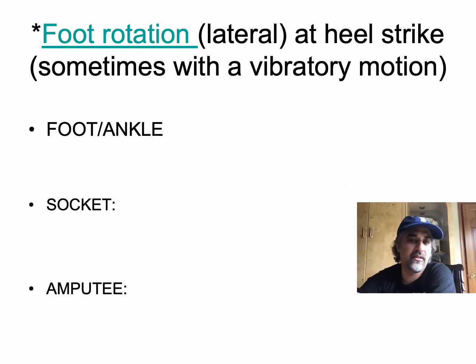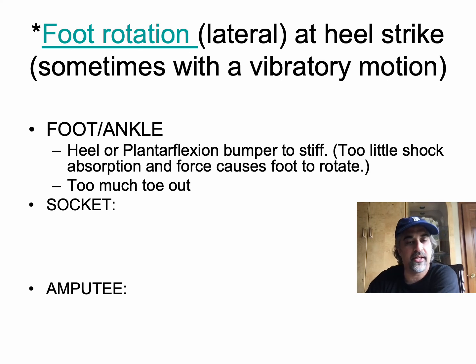If the foot rotates at heel strike with an associated vibratory motion, that could be that the heel or plantar flexion bumper is too stiff, or there's too much toe out.